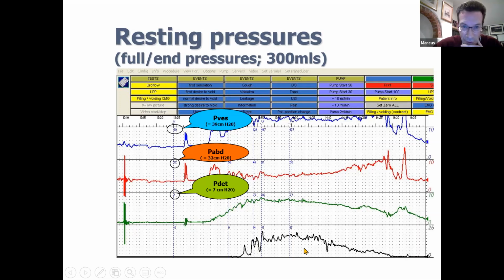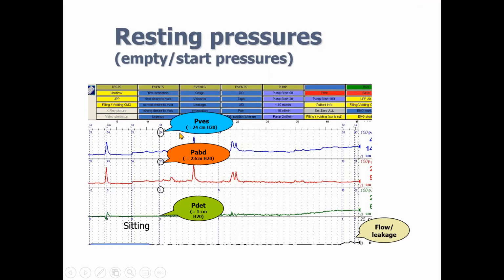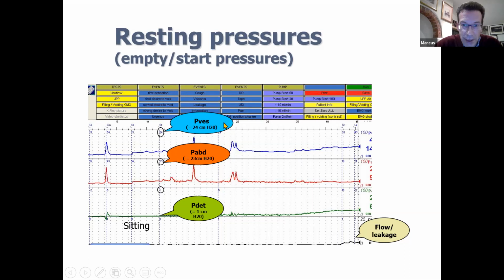This is obviously the voiding phase. I've had to explain that this is permission to void preceding this point. So I'm not sure if your uncertainty is because at this point you're seeing detrusor overactivity. Yes, yeah. So it's probably that it's plotted at a much broader time scale than you're used to seeing. You don't normally see an entire screen occupied by only 40 seconds of trace.